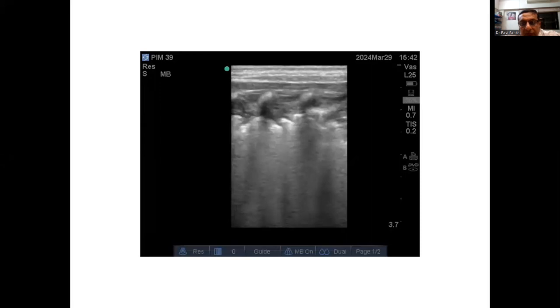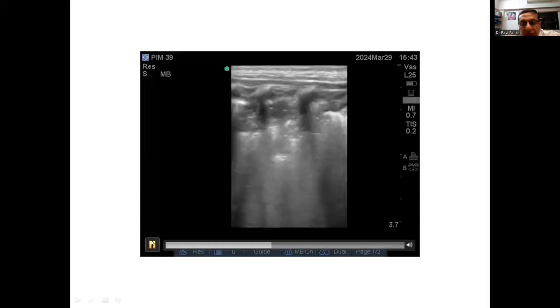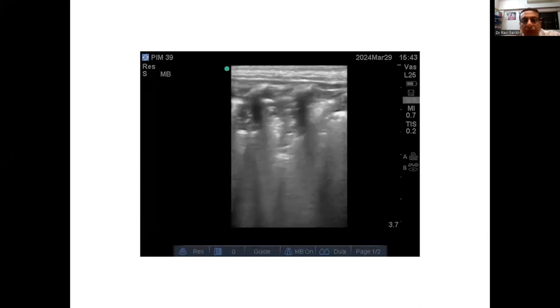So with atelectasis in particular, when you have an area of atelectasis that's quite large, you'll have consolidation below it, usually confluent with it. And if you have linear air bronchograms, it usually indicates that that might be recruitable lung. And that basically comes from a study that's called the Luster study, which we'll talk about on Sunday.